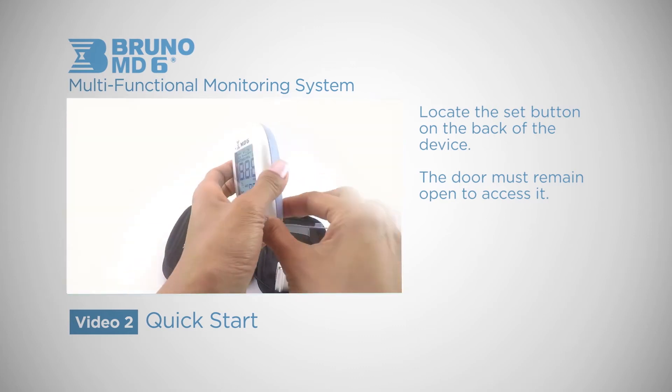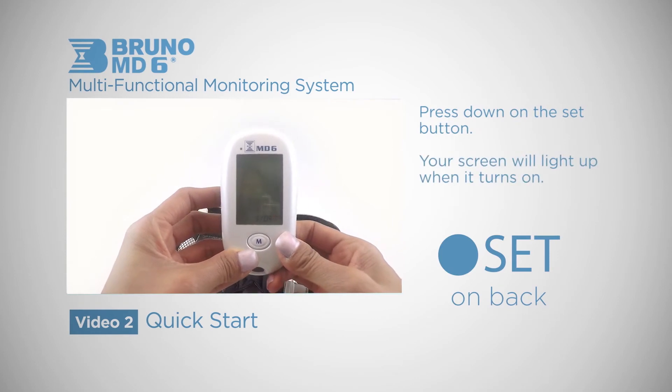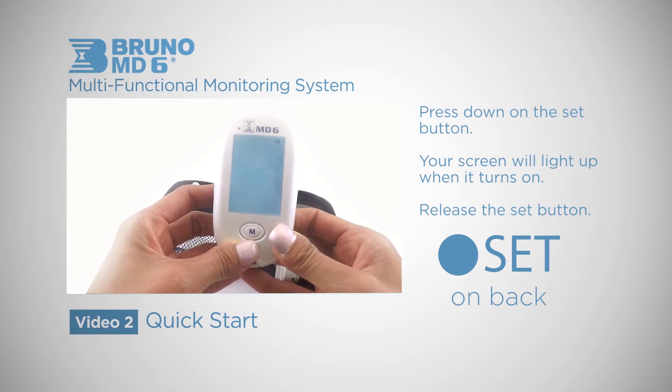Now turn it around with the back door open and press down on this button. You will hear a long beep and see your entire screen light up when it turns on. Release the SET button.